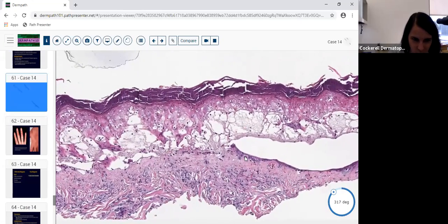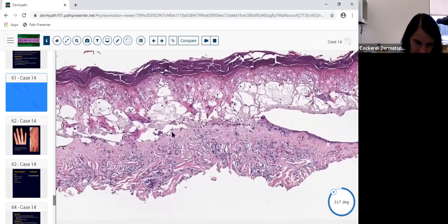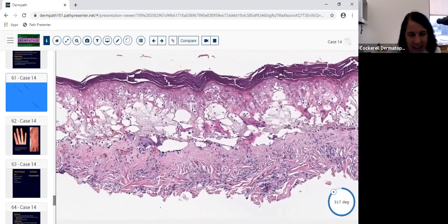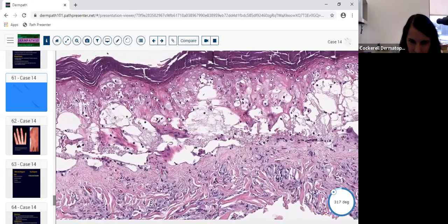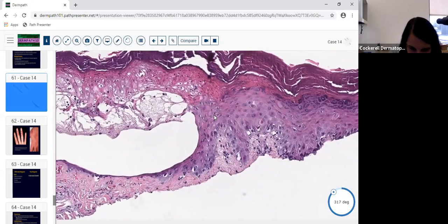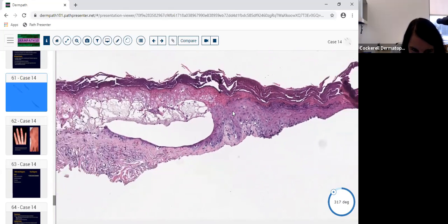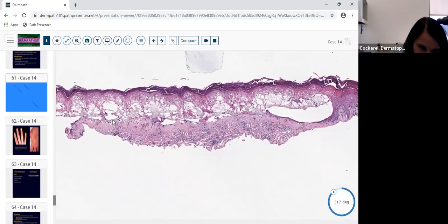Again, we're seeing some vesicles. We're seeing this may be re-epithelialized, or it could just be that it's intraepidermal. And I don't like to use the term acantholysis here. I like to use the term ballooning more, because I don't see separation between the cells. I see the cytoplasm more ballooning up. And when you get a process like this, you always want to look on the side for spongiosis. We can see prominent intercellular bridges here. You see more of a spongiotic appearance. And there's some papillary edema in this area. The papillary dermis is almost gone.